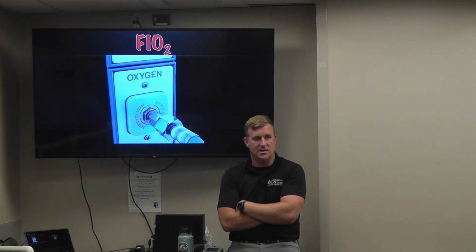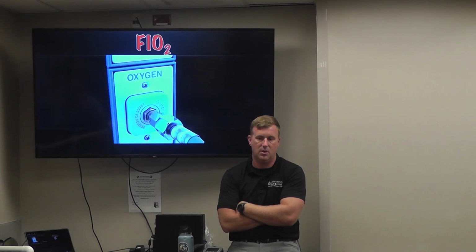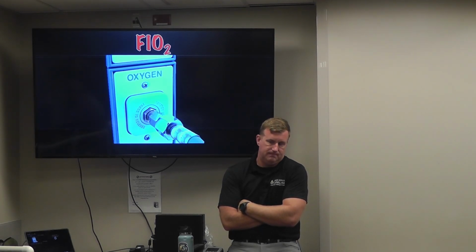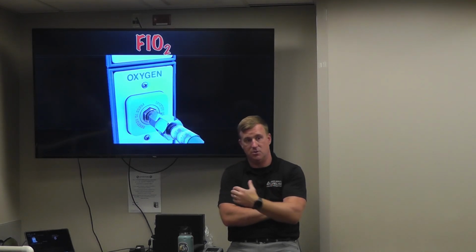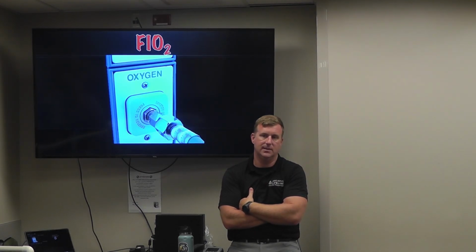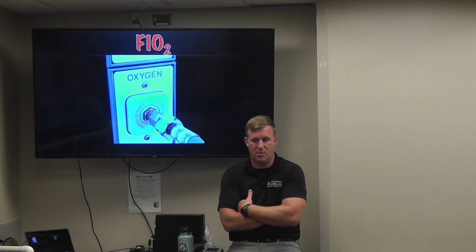Additionally, we know that hyperoxia is bad for people, right? Oxygen-free radicals, it's pro-inflammatory, all of that stuff. So my goal always, and I would hope that I can pass this on to you guys, is to aggressively down titrate FiO2. Because I have literally never seen a respiratory therapist turn FiO2 back up when I drop them off. However, if I drop them off on X amount of FiO2, they're going to stay that way for at least an hour, if not longer. So the goal, and for us as transport providers, I think this is a place that we can make a big difference, is getting people's FiO2 down.